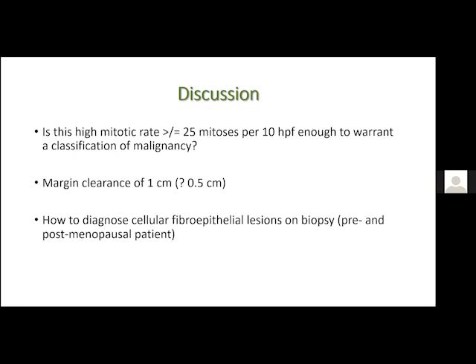And these fibroepithelial lesions, as probably every single one of us on the call knows, they are so heterogeneous, they just don't follow any rules. And this is just one like that, an exception to the rules. It's kind of the one you wonder if this hadn't been excised for maybe 6 months, then we would have been seeing stromal overgrowth and an infiltrative growth pattern. But we catch these earlier because of imaging perhaps, and they're excised at an earlier date. So hard to know.